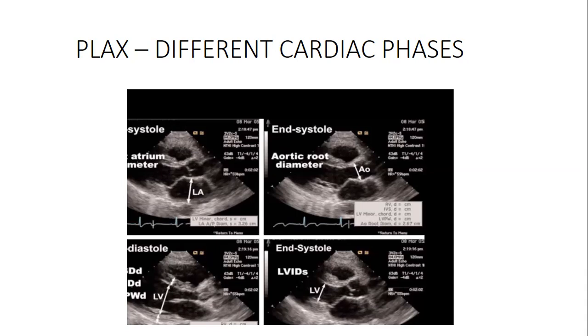I have a question, Mr. Mulenga. I just wanted some clarity on the Nyquist limit and aliasing, simply and properly, and its application in color Doppler. Sorry, its application in echocardiography. That's the first question.